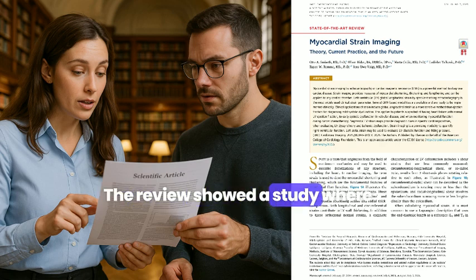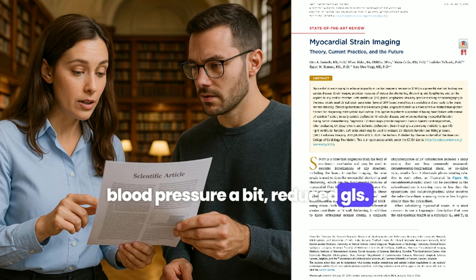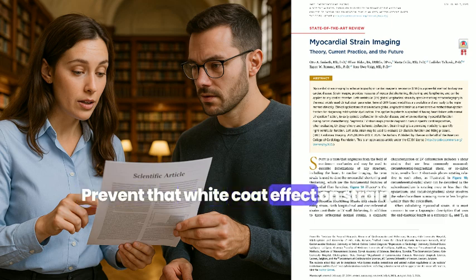The review showed a study where even mild mental stress raising blood pressure a bit reduced GLS. It really highlights why you should record BP during the scan and maybe avoid stressing the patient out. Prevent that white coat effect on strain.